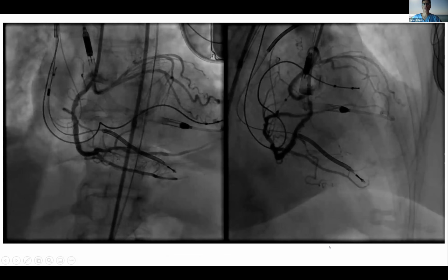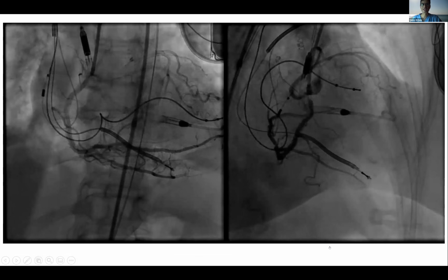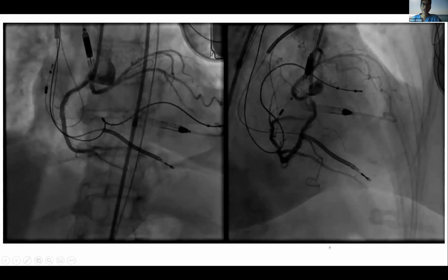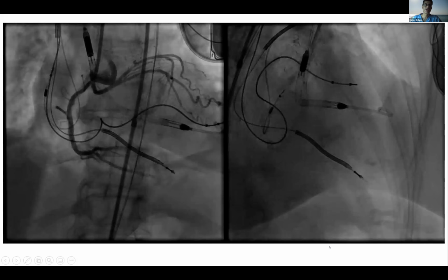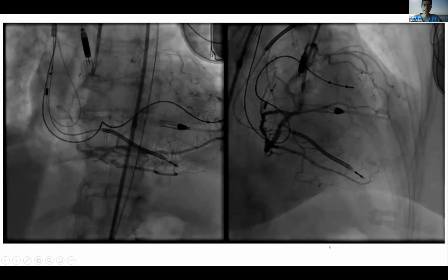So here it's probably going to be less useful, because the other vessel, the right coronary, essentially doesn't seem to have that horrible disease at the beginning. Then again, there's a good angle. It looks like close to a 90-degree angle between the RCA and the left-sided vessel. I think you're probably okay. I mean, obviously you worked out very well the way you did it.